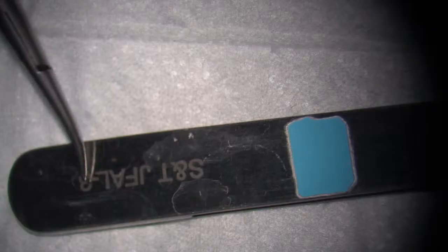Are the curved tips preferred compared to a straight tip? For different purposes. This is the angled forceps, long 3. The angled forceps is helpful when we pass something under the vessel. The straight forceps is easier to use when we're doing dissection. And this round handle can turn a little bit easier. Sometimes the suture is not in this direction but in that direction, and we need to turn and catch it easily. Otherwise we have to turn our hand a little bit to pick it up, which is more challenging.